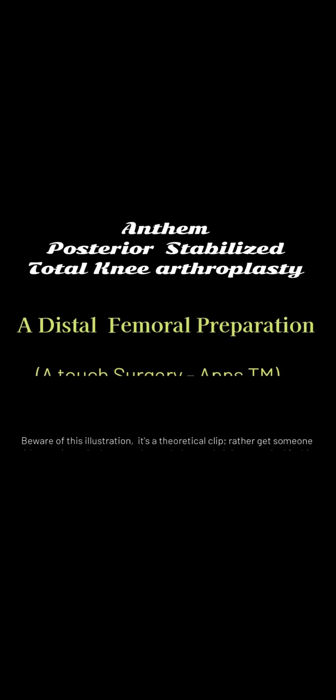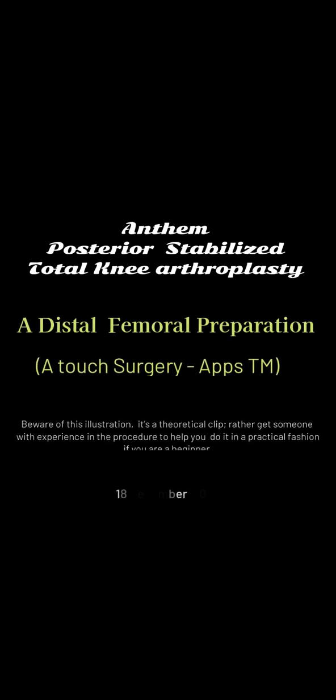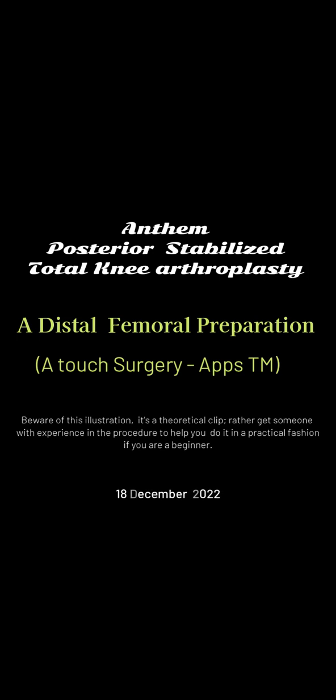Anthem Posterior Stabilized Total Knee Arthroplasty: Distal Femoral Preparation. A Touch Surgery APPS production. Beware — this is a theoretical clip. Get someone with experience in the procedure to help you do it in a practical fashion if you are a beginner.